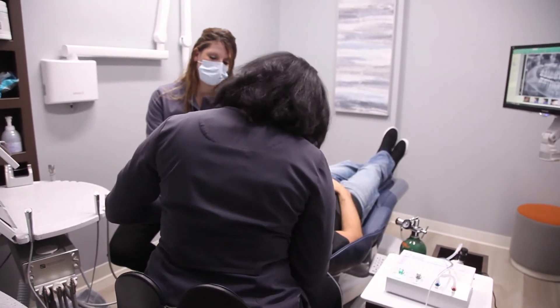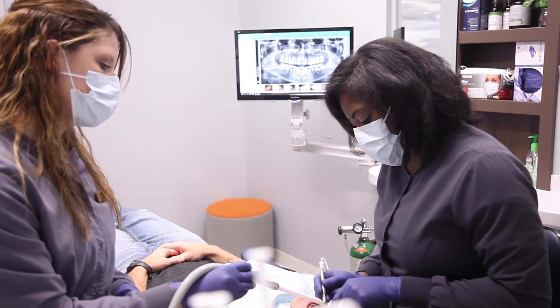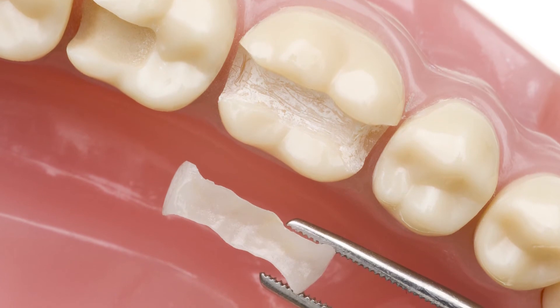Between the corrosion, the secondary decay, the cracks, and the leaking fillings, a lot of times those have to be replaced. When they are replaced, we want to do so safely, and we want to replace them with materials that are biocompatible, like ceramics and resins.